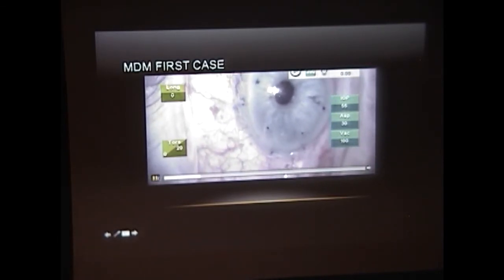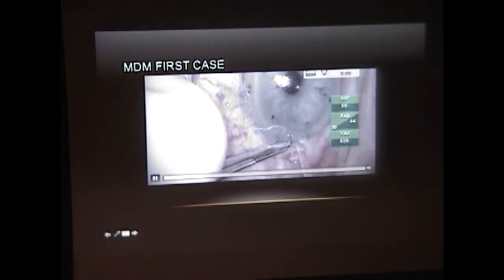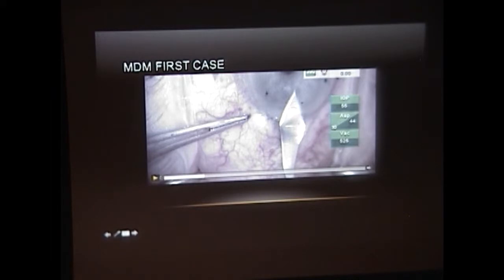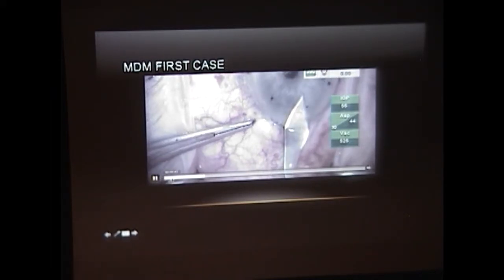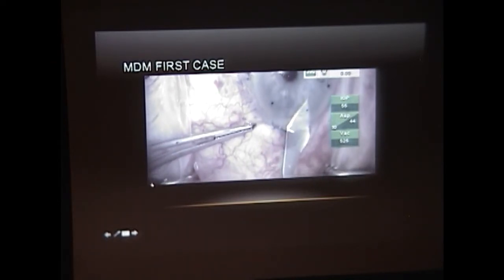And skipped a few points there, and the Descemetorhexis is removed. And now we're just checking the size. That's that Straiko modified Jones tube. We're just checking the size of the injector. It wasn't fitting quite as we wanted, so enlarging the wound a little bit.